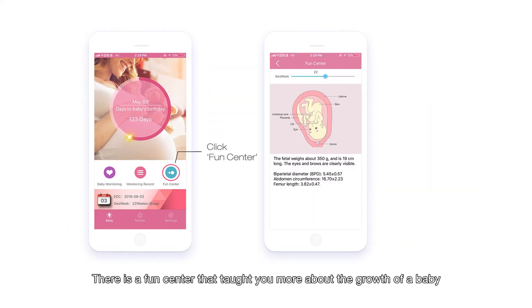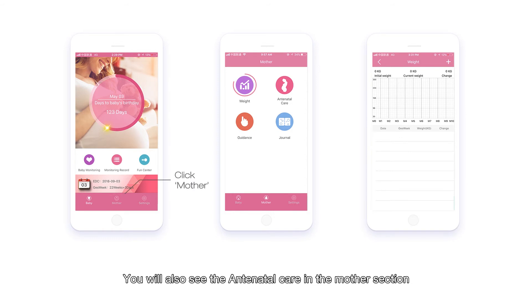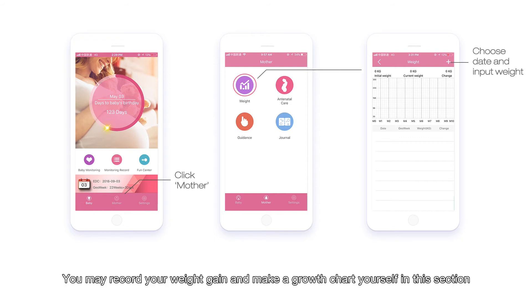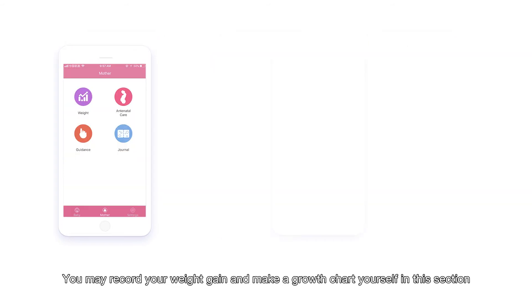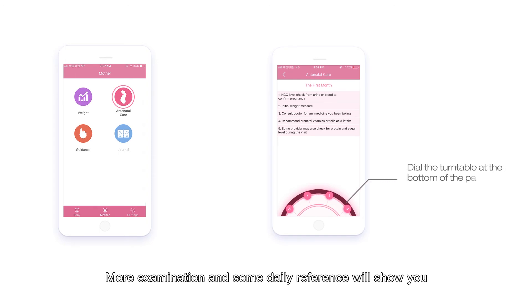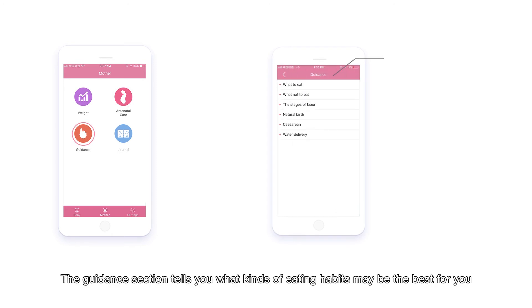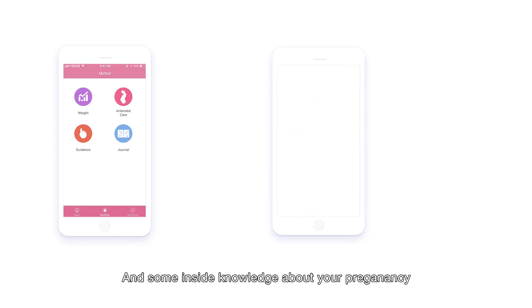There is a fun center that teaches you more about the growth of a baby. You will also see the antenatal care section in the Mother section, where you can check weight and other information, record your weight gain, and make a growth chart. More examination instructions and daily references will be shown, along with guidance on eating habits and inside knowledge about your pregnancy.